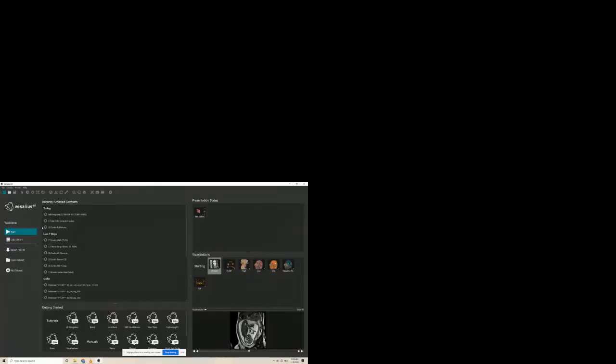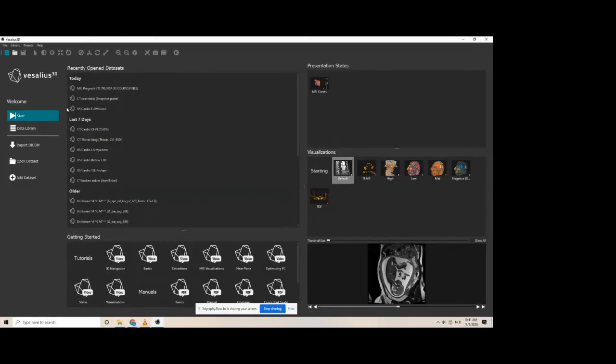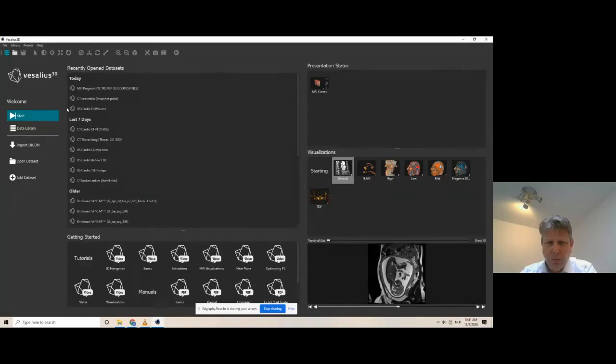Just the ease of use is where I would like to go over, because Mark is an expert and he can talk real easy because he's been doing this, I would almost say, all his life. But I'm less experienced, although I've been with him for a long time. The moment you start with Vesalius, I would like to put it in a little bit broader perspective. As was said before by Stefan, we read DICOM images. So DICOM can be any type of data that is generated in hospitals, being MRI, for example, or CT, ultrasound, all that type of information can be read into Vesalius.